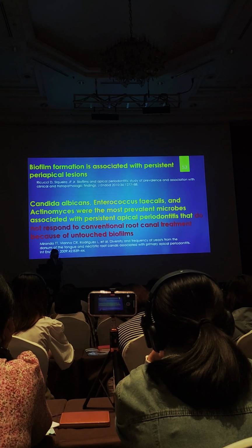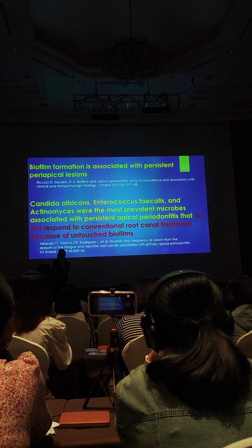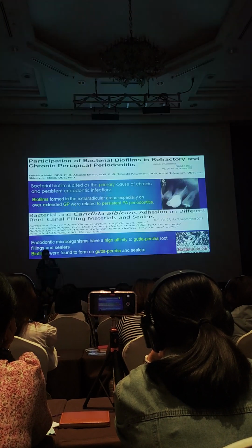But I want to suggest another alternative to remove them, but that is MTA.